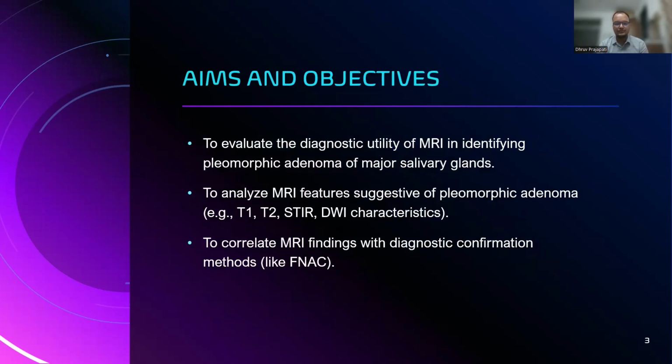Aims and objectives of the study: to evaluate the diagnostic utility of MRI in identifying pleomorphic adenoma of the major salivary glands; to analyze MRI features suggestive of pleomorphic adenoma on T1, T2, STIR and DWI images; and to correlate MRI findings with a diagnostic confirmation method like FNAC.